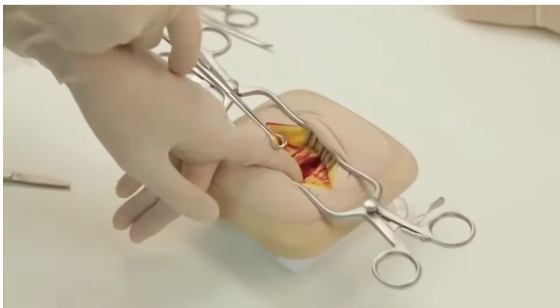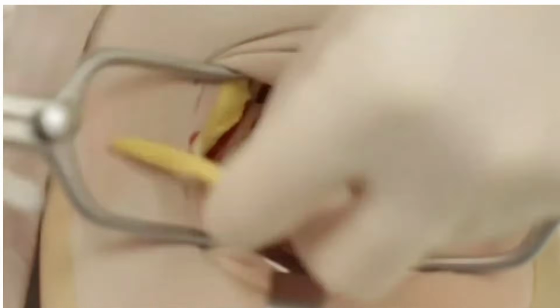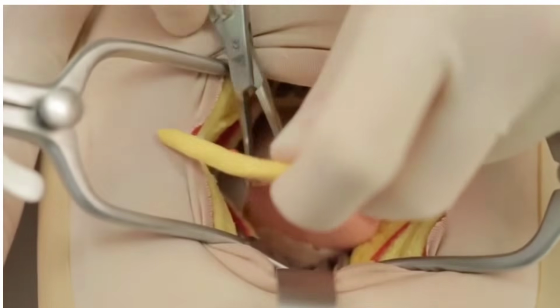If a mesoappendix is present, divide it with serial clamps and ties or a vessel sealing device. Control the appendicular artery securely. Mobilize the appendix fully to its base.